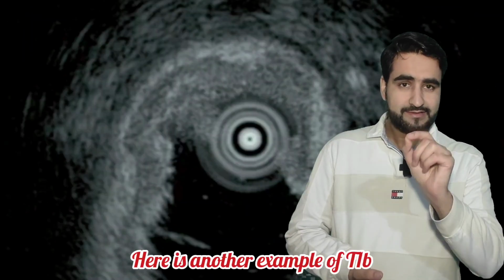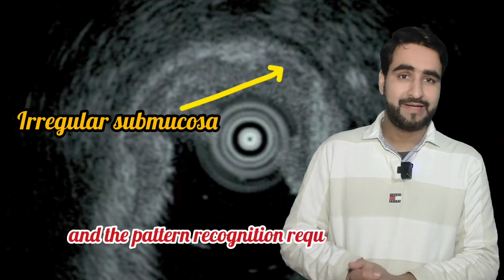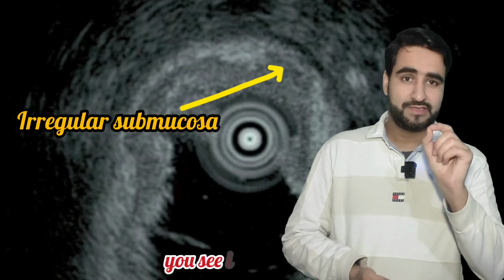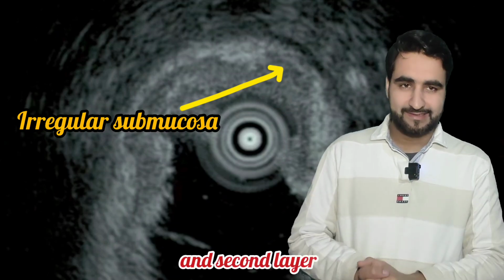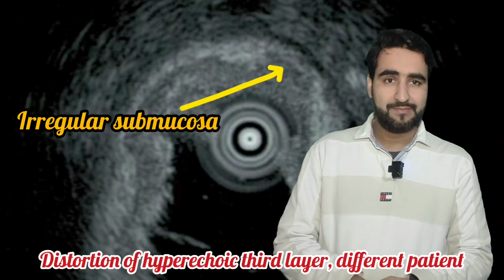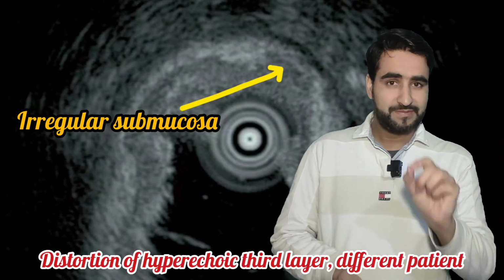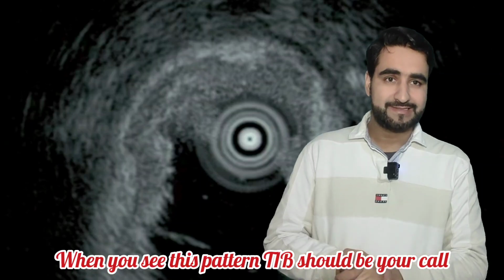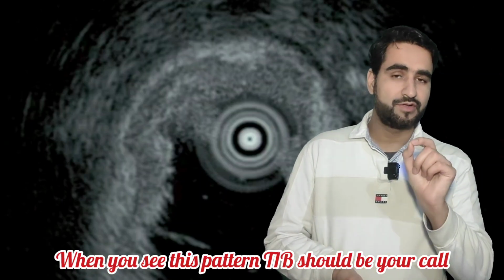Here is another example of T1B. This distinction is important, and the pattern recognition requires repetition. Once again, you see irregular first and second layers, distortion of the hyperechoic third layer. Different patient, same diagnostic fingerprint. When you see this pattern, T1B should be your call.